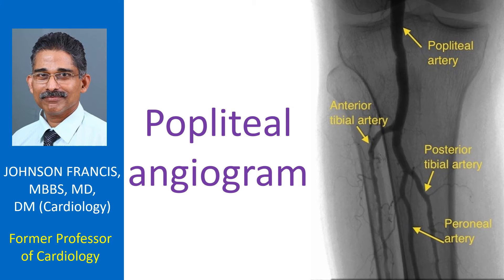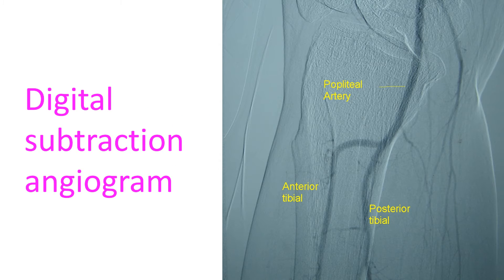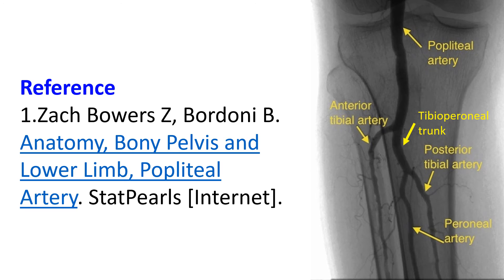Femoral angiography comes under the broad group of peripheral angiography. This is a digital subtraction angiogram of the popliteal artery showing the artery dividing into anterior tibial and posterior tibial arteries. No luminal filling defects are seen. Upper ends of tibia and fibula are seen in profile. Usually the popliteal artery divides into anterior and posterior tibial branches, and the posterior tibial gives off a peroneal branch.